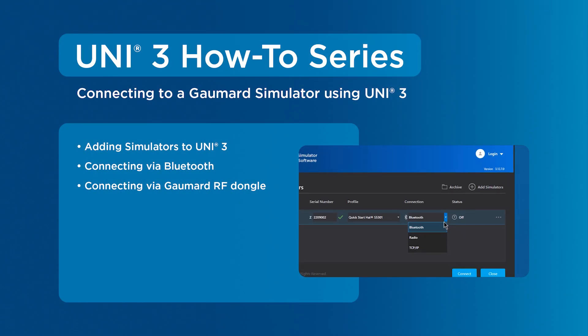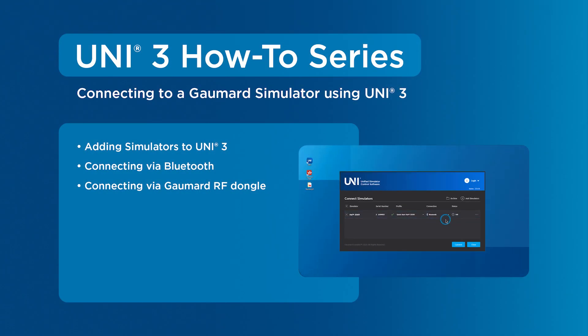This tutorial covers connecting your GoMard simulator to Uni3. First, we will cover adding your GoMard simulators to Uni3.